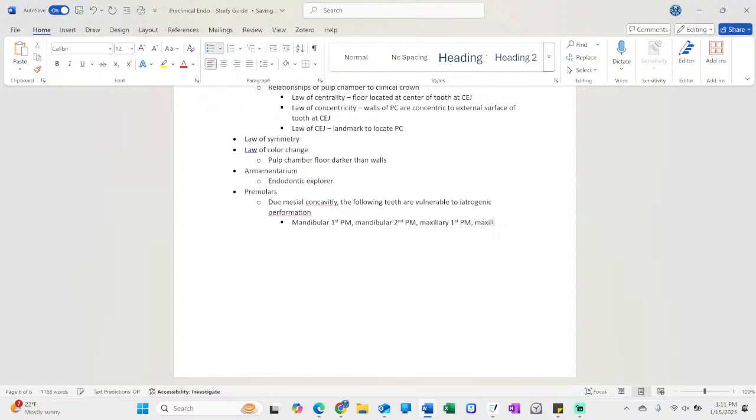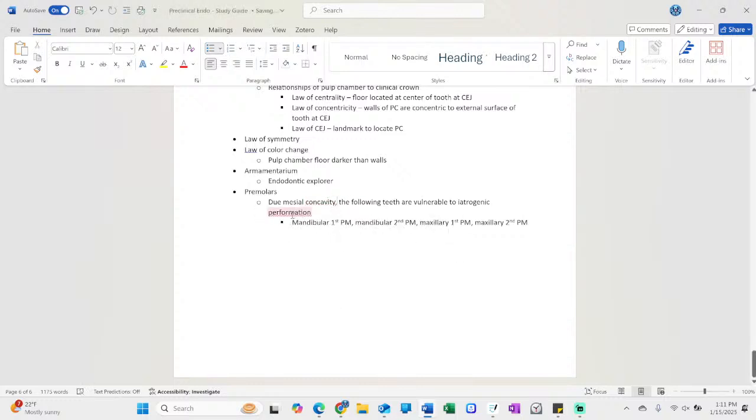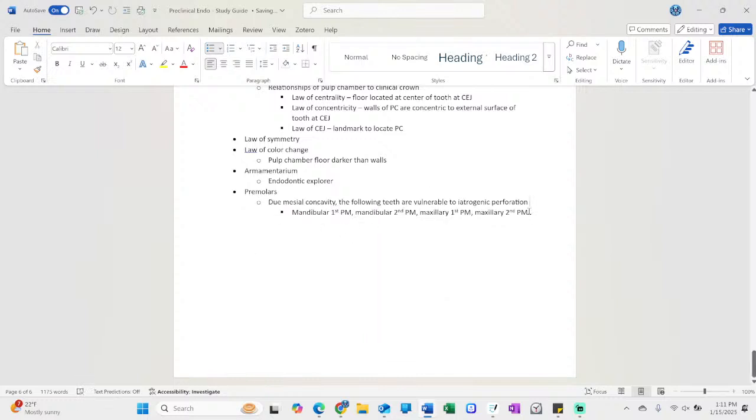As you all experienced, it's hard to find good teeth when you're x-raying them. I couldn't find any molars, so I thought, I'll do a maxillary premolar. That's easy. It's got 2 roots, and access is just an oval, so I'll be fine. And I almost perforated out the mesial. Everything worked out, obviously, but that mesial concavity can really trip you up sometimes.